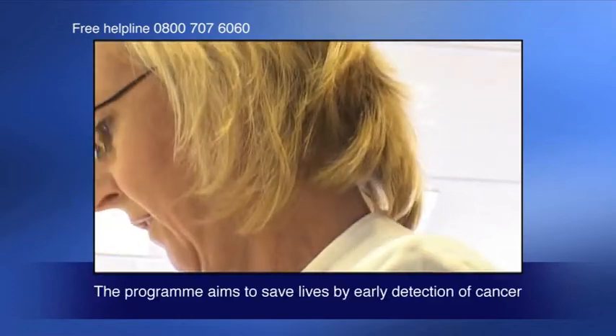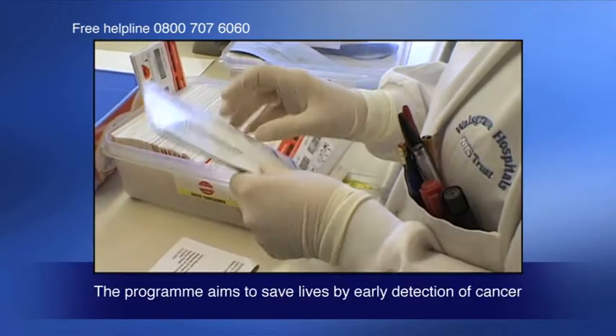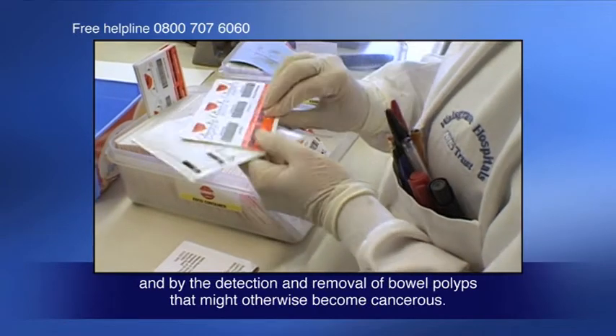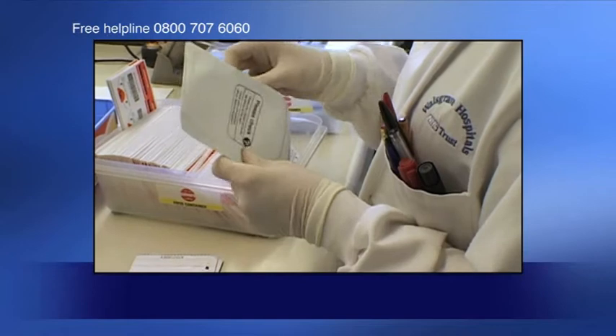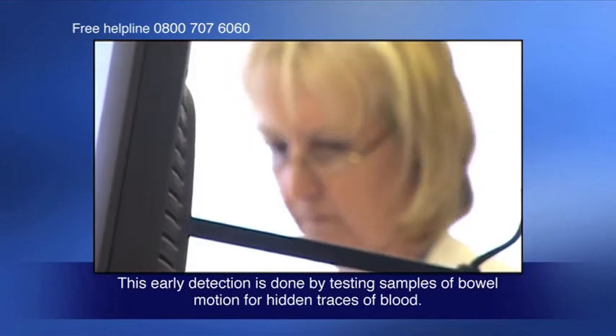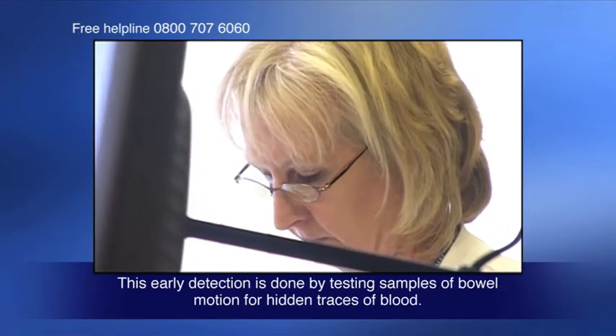The program aims to save lives by early detection of cancer and by the detection and removal of bowel polyps that might otherwise become cancerous. This early detection is done by testing samples of bowel motion for hidden traces of blood.